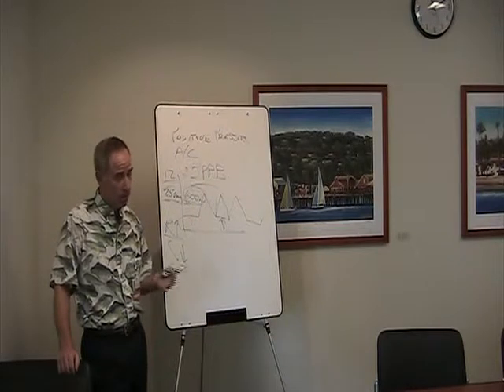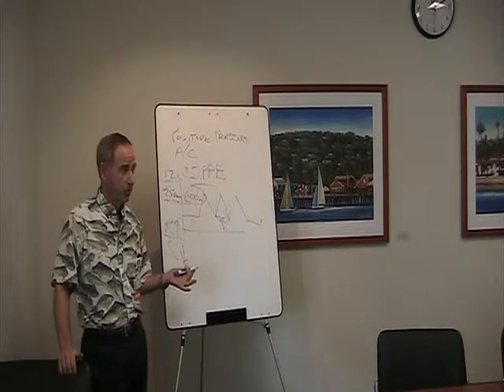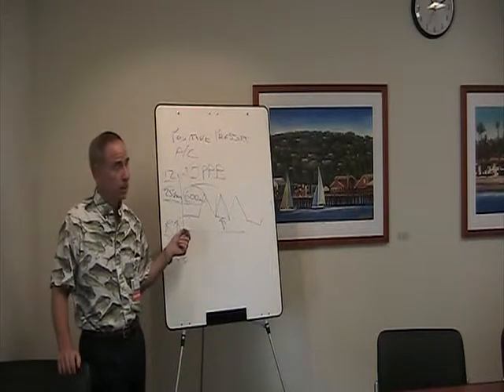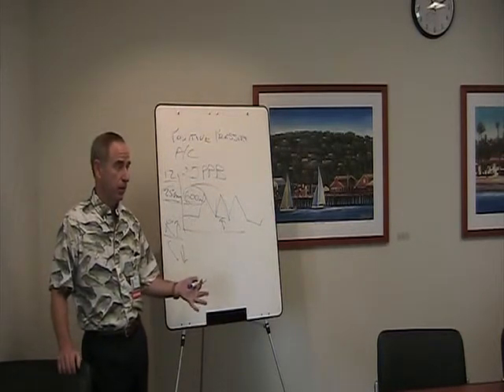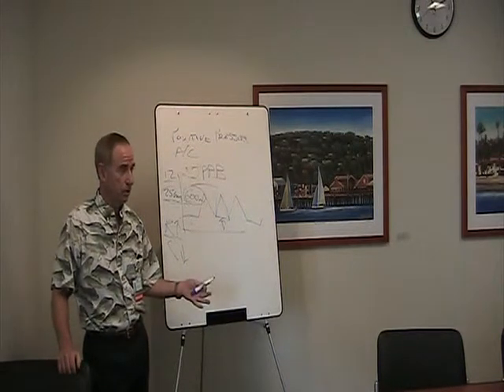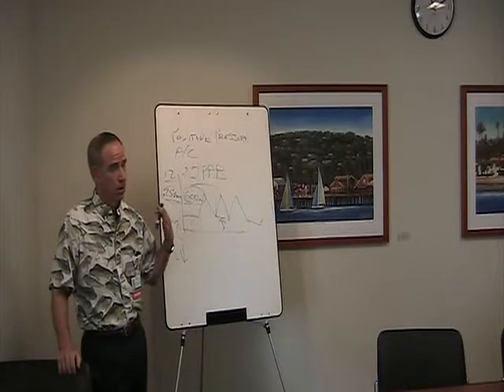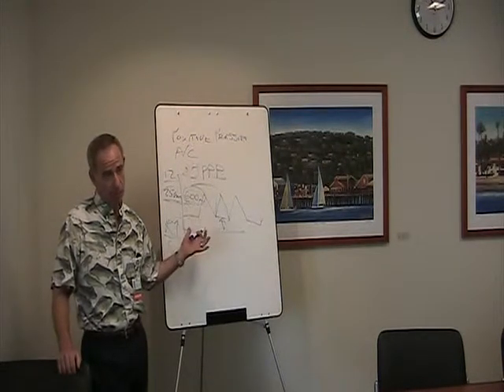Okay. But the point of the story is the changes in compliance and resistance. If you're using a pressure mode of ventilation, a pressure cycle ventilation, you're not going to deliver the volume or the minute ventilation that you need to adequately ventilate that patient. Okay, so that was the problem with pressure ventilation.